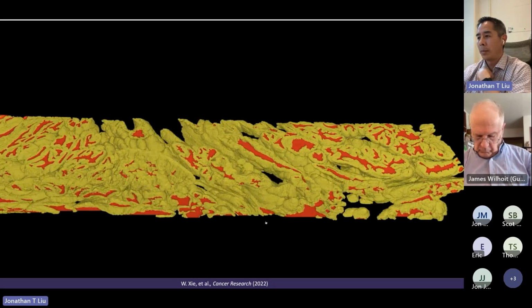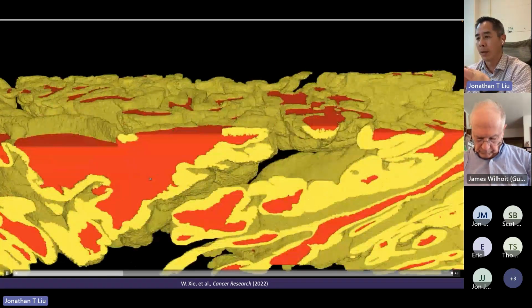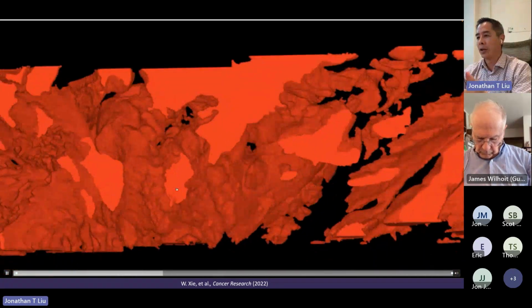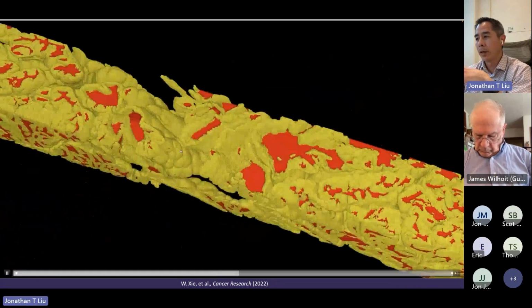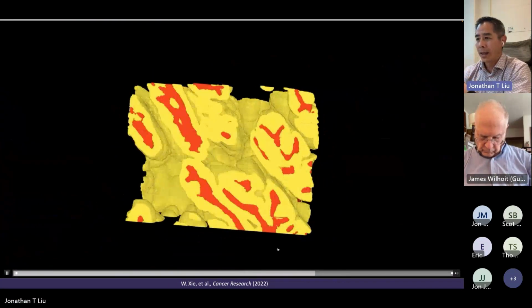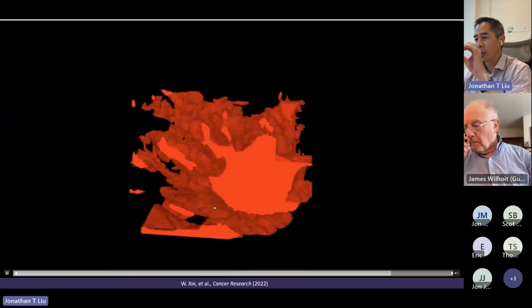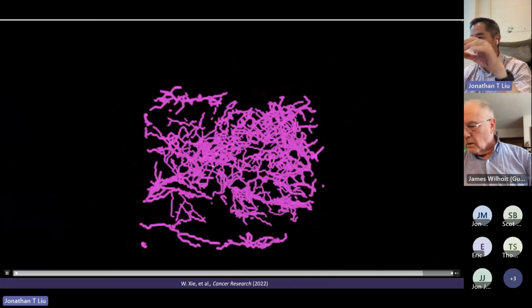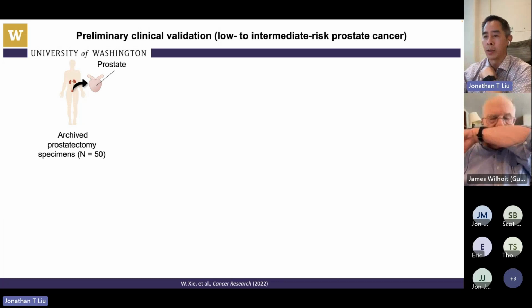This is what a prostate biopsy looks like in 3D once we've segmented the gland structure. So this, again, is about a 1 millimeter diameter. We fit it into this rectangular channel to image it, so it no longer has a cylindrical shape. But from here, you can see it's a very complex structure of glands, snaking through even this 1 millimeter core. You can see a lot of information. We can even extract the skeleton network. This is the center line that meanders through the gland network. And from there, we can pull out a lot of quantitative parameters to start to describe those glands.